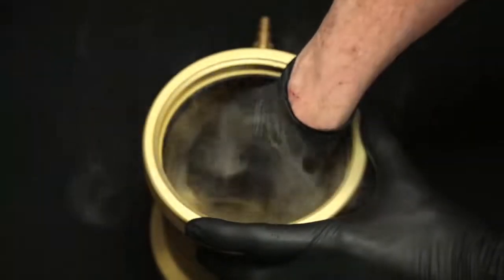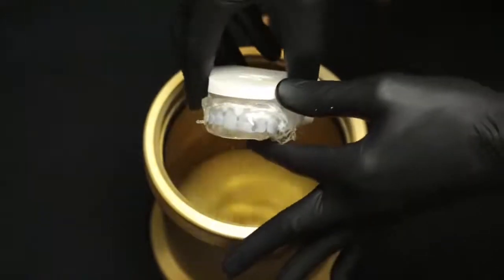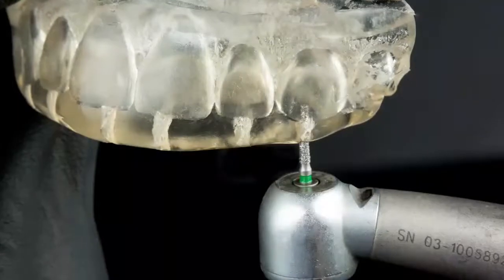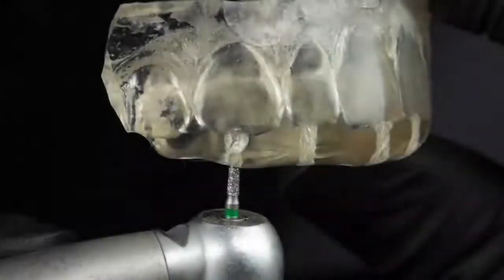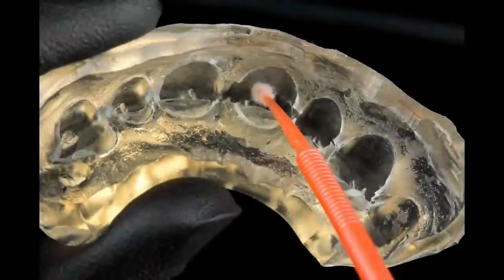Notice the clarity of the material and the lack of air voids. A small opening was made above each tooth that was to be restored using a tapered diamond bur, a 6847 by Brasseler. It is important to clean the internal surfaces with a micro brush to prevent silicone debris from incorporating into the flowable material.